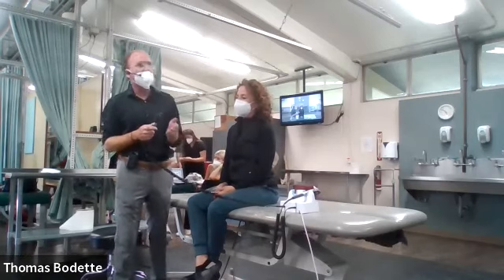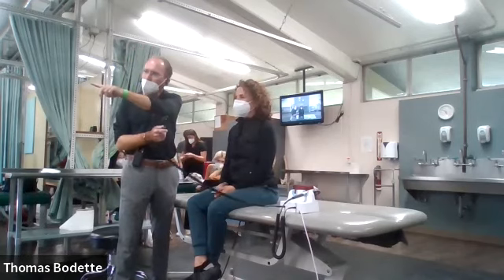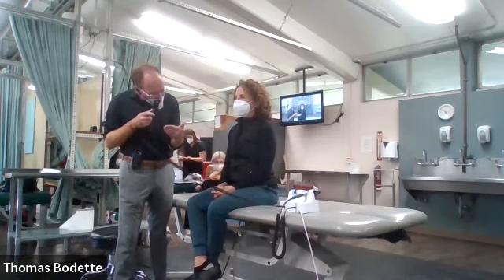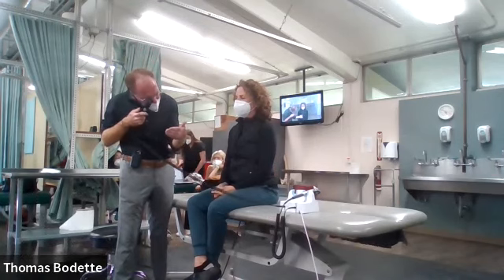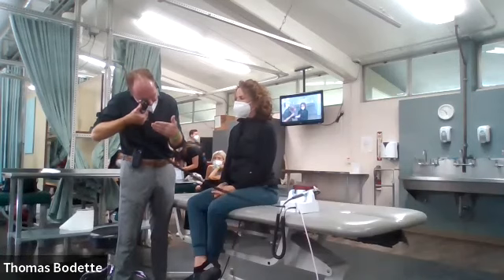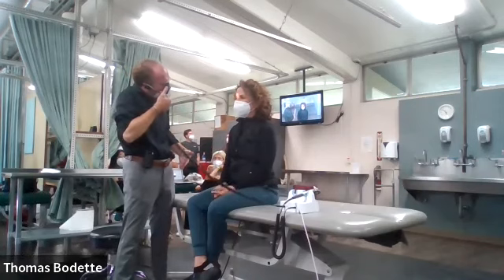All right, instructions. I'm Dr. Bodette. What I'm going to have you do is keep your head still and focus on a point in the distance. Try not to move your eyes too much. Okay, first step, make sure your light source works. I'm going to be looking through my right, and I'm going to focus on my hand to start with. And I'm going to have my hand on the diopters so I can refocus.